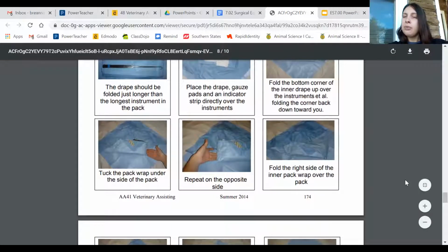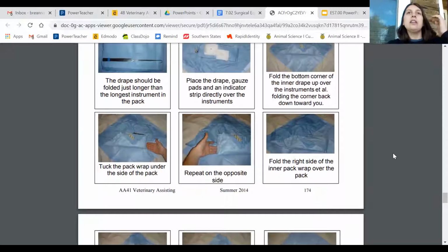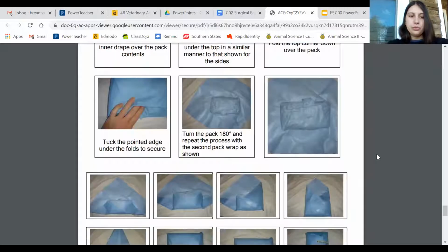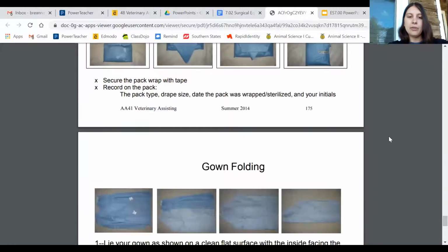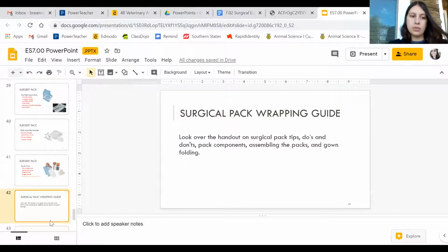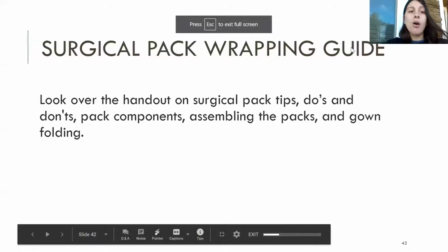I really like the video of the woman showing us how to wrap that surgery pack, because it's easier for me to watch the video than it is for me to look through these pictures and try to figure out what exactly they did. You can see the envelope style, always leaving the little tab. Then it tells you about gown folding. So just look through that, a lot of helpful information.